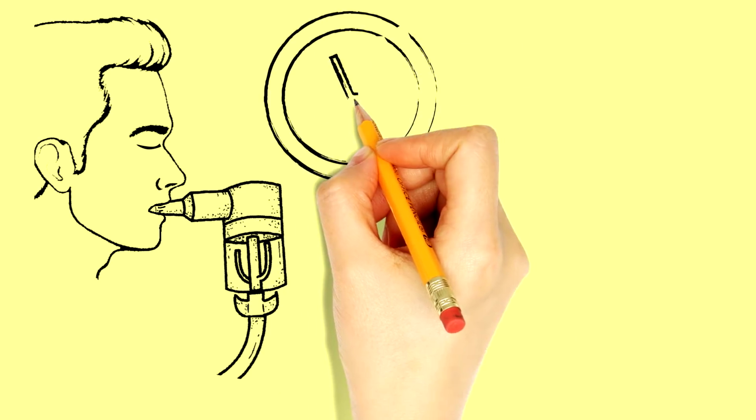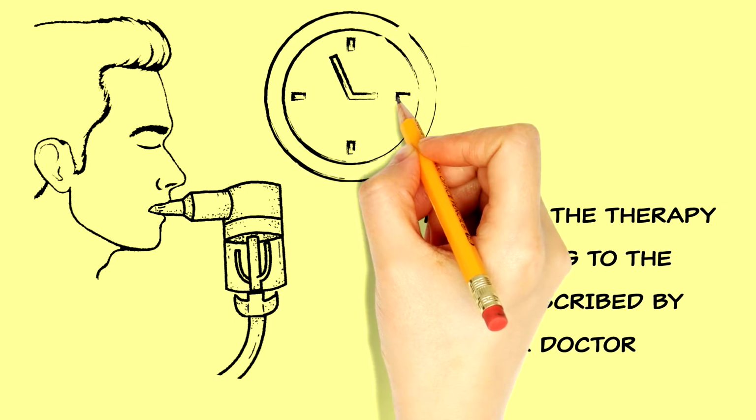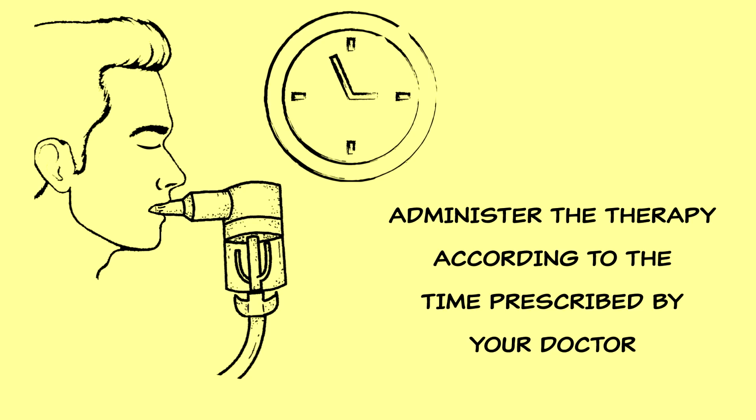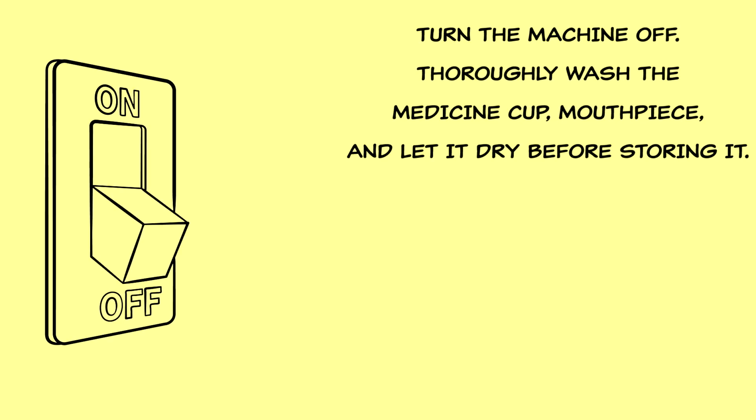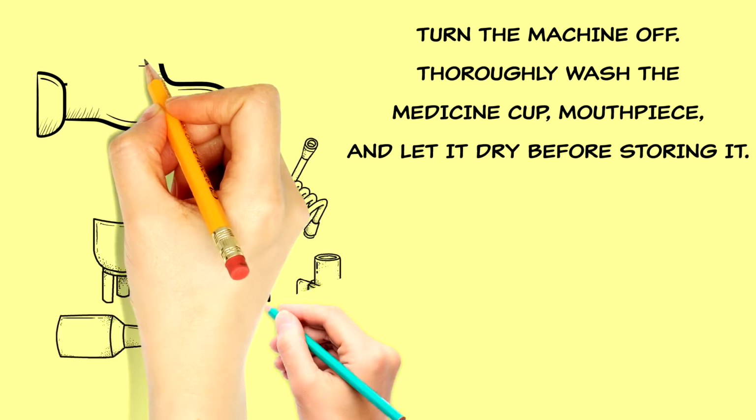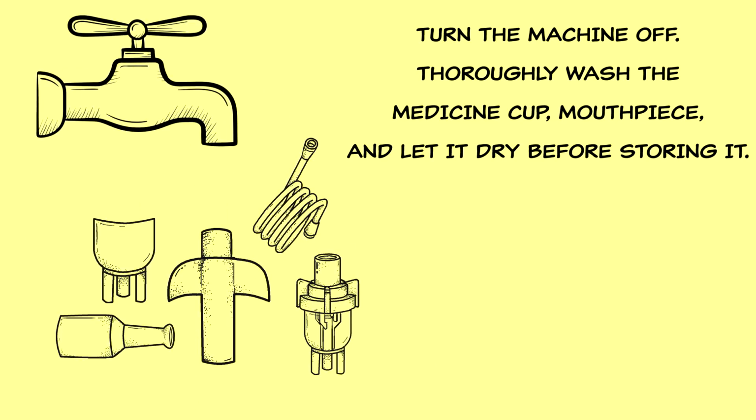Administer the therapy according to the time prescribed by your doctor. Once complete, make sure to turn the machine off and thoroughly wash the medicine cup and mouthpiece. Let it dry before storing it.